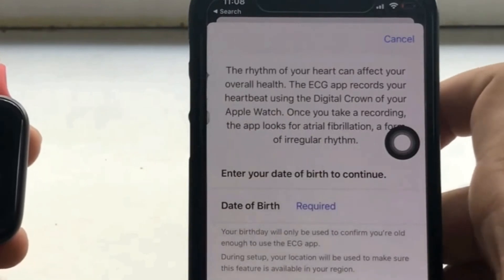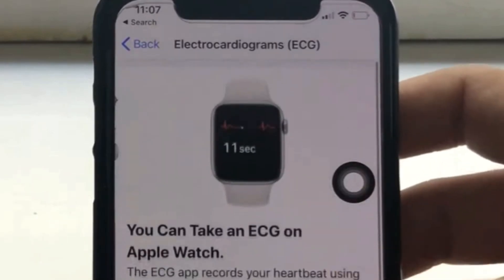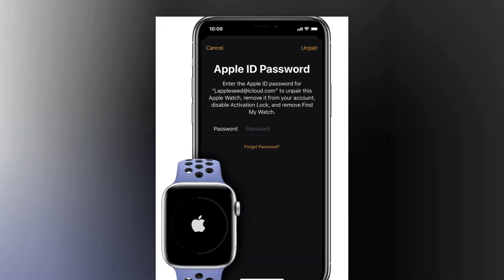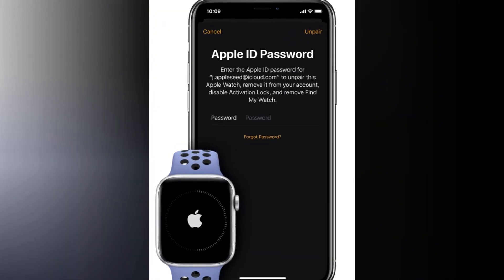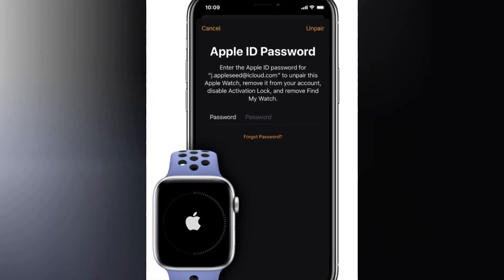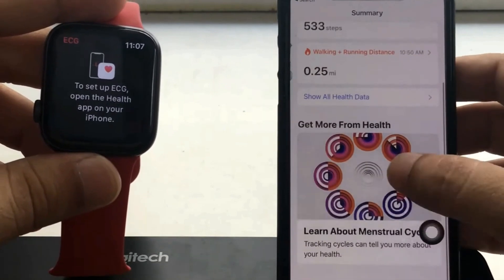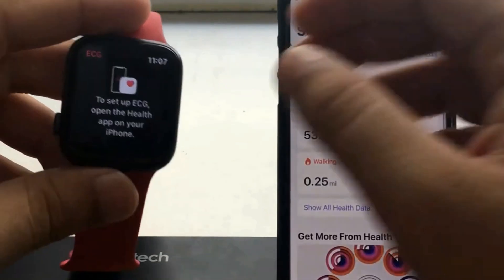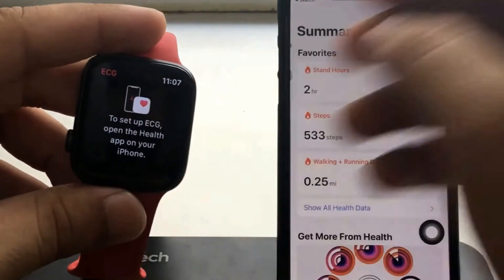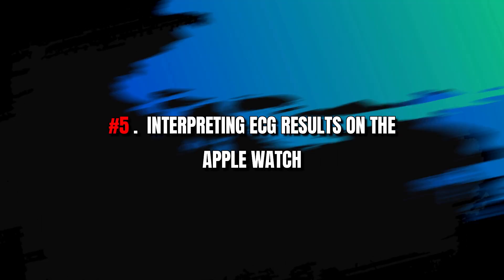Follow the prompts to finish the setup, which may involve agreeing to terms, entering your Apple ID password, or providing necessary details. After setup, you'll find the ECG app icon on your Apple Watch's home screen.